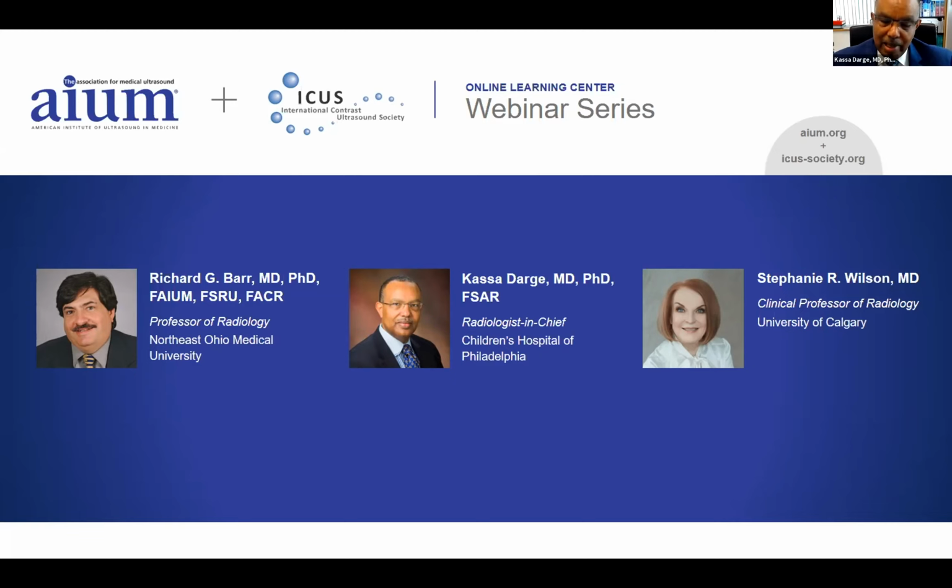And over time, everyone was able to learn. In our body imaging division, we have some 25 pediatric radiologists, and everyone does contrast ultrasound. In addition, the colleagues in the division of interventional radiology, about 7 people, all of them do contrast ultrasound. So it's not dependent on one doctor, but spread to everyone. That really supports the widespread use of this modality.